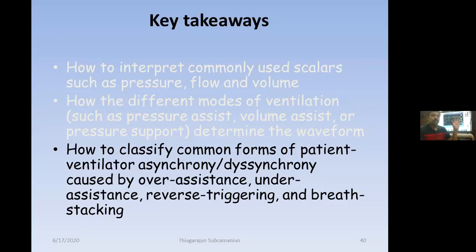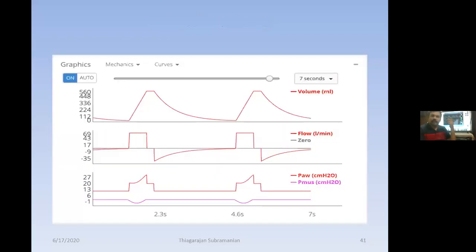So these are all the few points we always have to be aware of. I know some of the students may not understand in depth, so it requires some time to practice, and then only will we get to interact with this. So these are the example scalar waveforms.